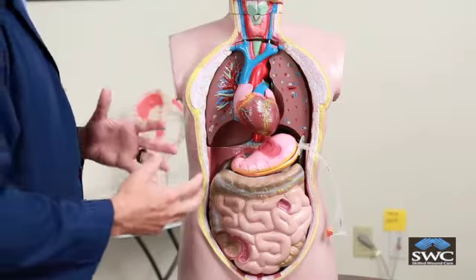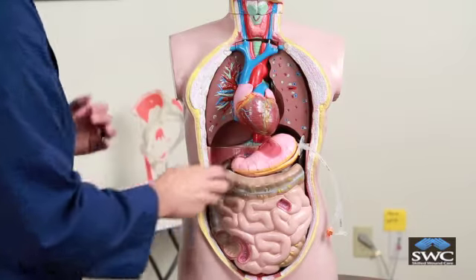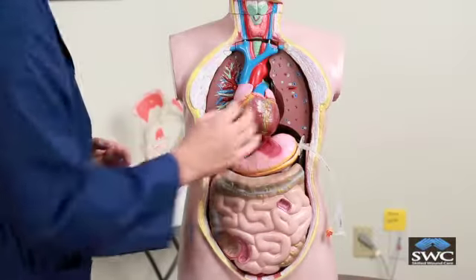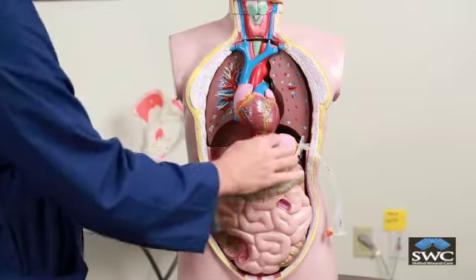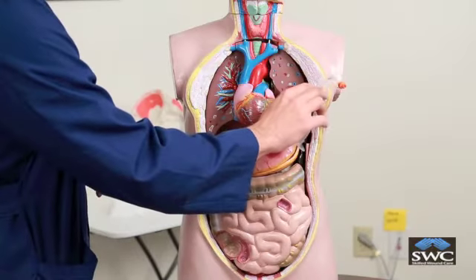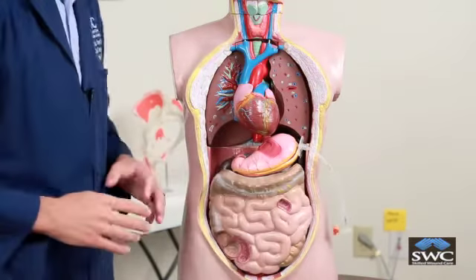Now, the advantage of gastrostomy tubes is that we're feeding directly into the stomach and we're not feeding nutrition through the vein or peripherally, so it's preferred to always feed the patient through the gut. This is a bypass going directly into the stomach. This is a balloon gastrostomy tube, and it's important to always note what type of tube the patient has placed in.